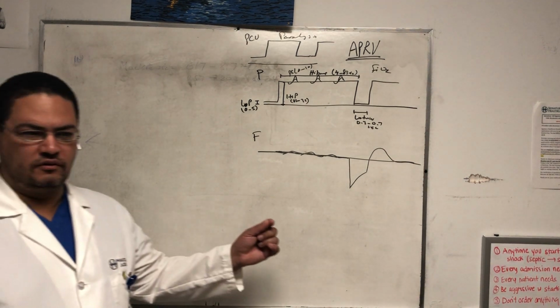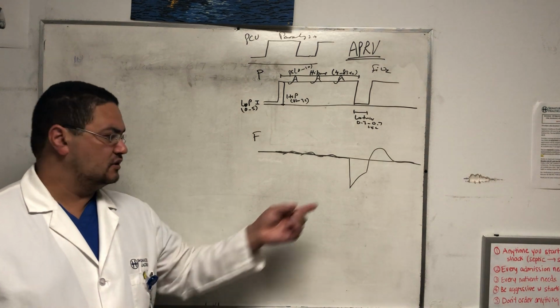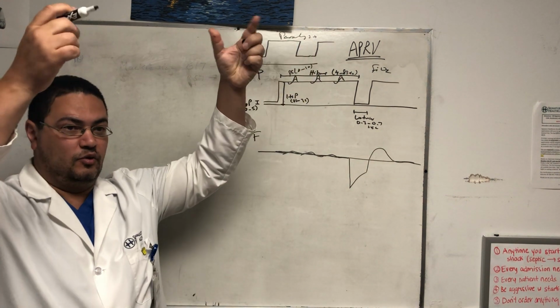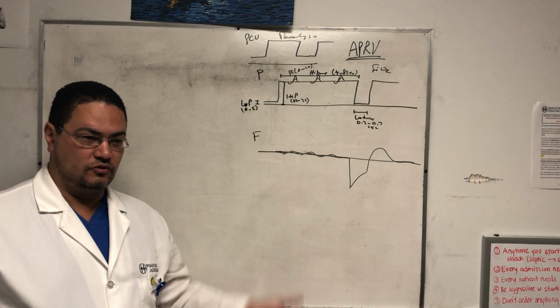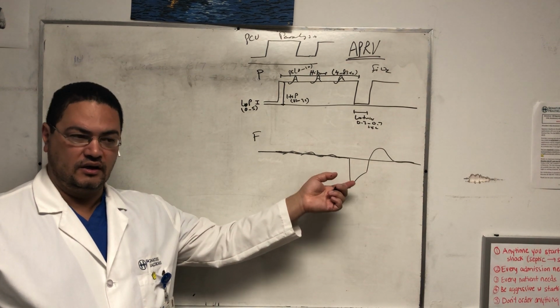So the majority of the movement happens in the negative direction, in this situation here, as you're falling from the Niagara Fall. Boom, the pressure just falls from very high to very low, and you get a relatively huge breath here, which is called the release breath.